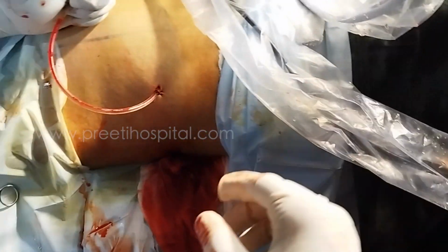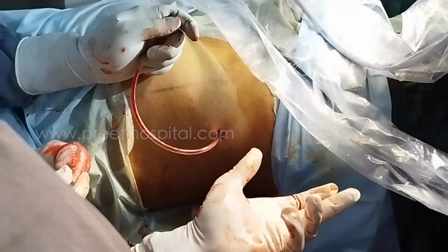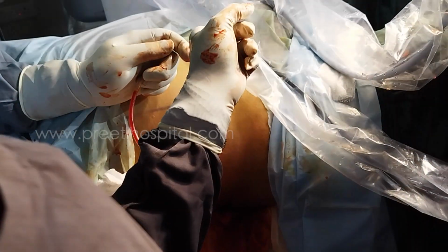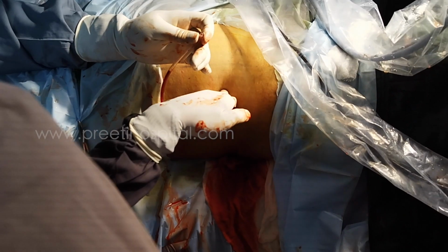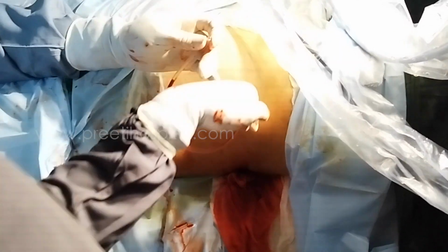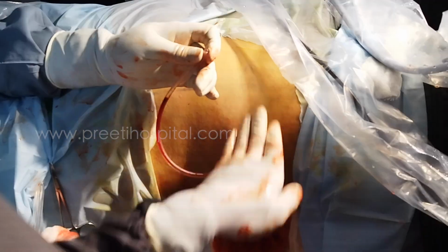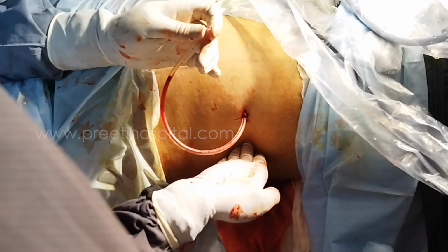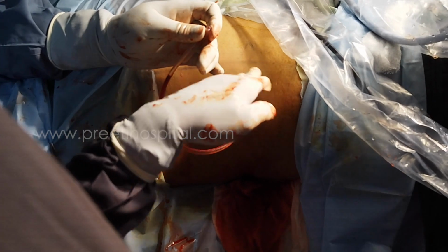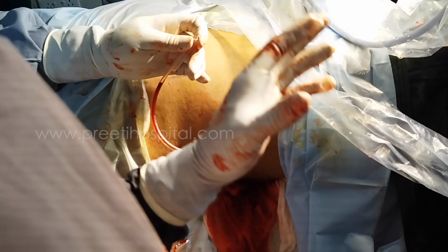You clamp, you will put it for 1 hour, 2 hours. After that you remove. If any problem is there, 2 calyxes only: upper calyx, middle calyx. If the calyx is moving, okay. If it is not going, go down. If it is moving very heavily, go below the puncture. Or else go up. If it is moving heavily, go 1 step up. Always err on the posterior side and gradual ascent. Then you are very safe. And horizontal puncture is very safe. Bleeding is very less. Thank you.